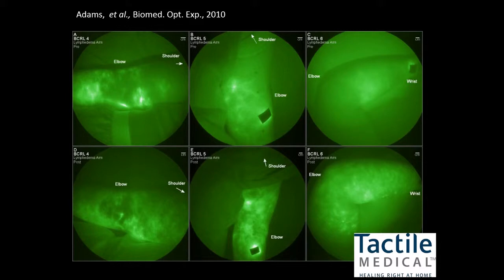In this last case, you see that after an injection near the wrist, there's no dye, but after the treatment, you see that dye has moved proximally to those draining lymph nodes. The idea of moving that fluid towards a functional lymph draining bed is the basis of these technologies and the basis of MLD therapy.